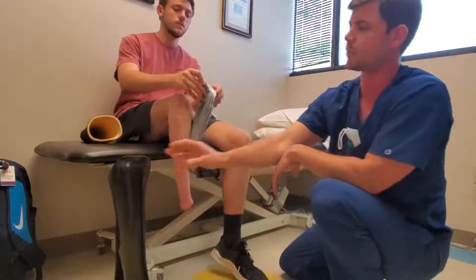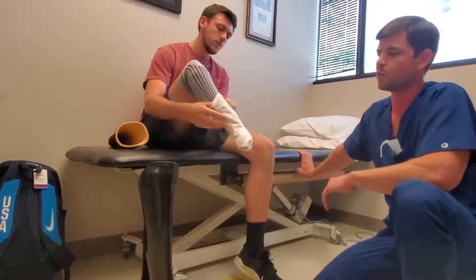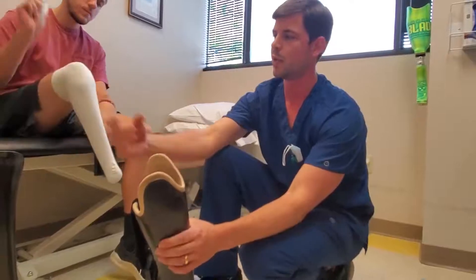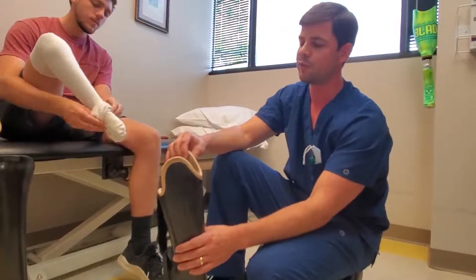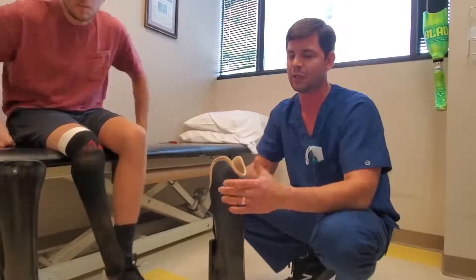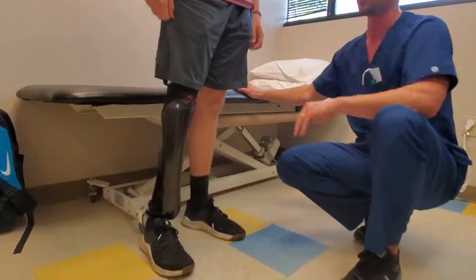I'm going to have Alex put his leg on so you can see. He wears a sweat-wicking sock on his skin and sometimes adds another one to two ply depending on what he's doing. He's done a lot of walking this morning, so he's socking up a little bit. We also transitioned from an eight or ten millimeter P-light to a six millimeter P-light, which cuts down on the bulk and weight of the prosthesis. As he's gotten stronger over time, he doesn't need as much padding, and decreasing weight always reduces energy expenditure, which is a good thing.